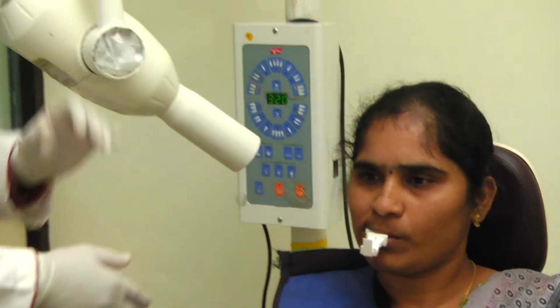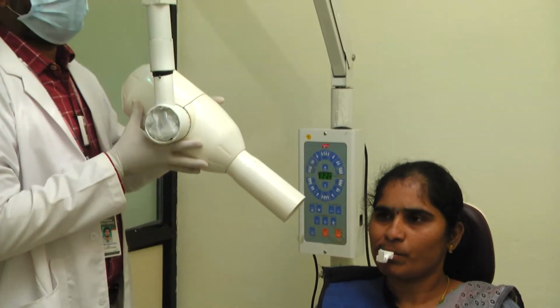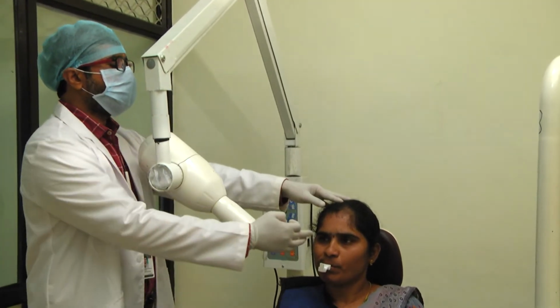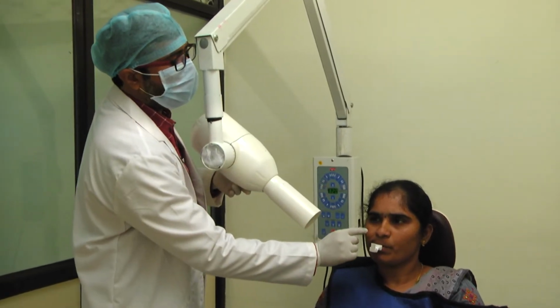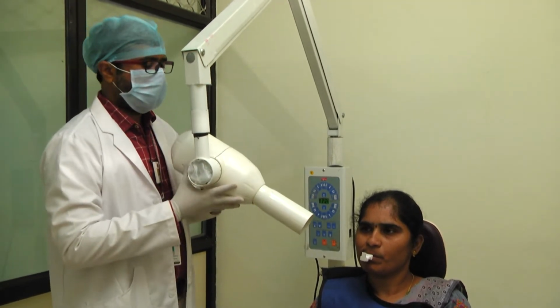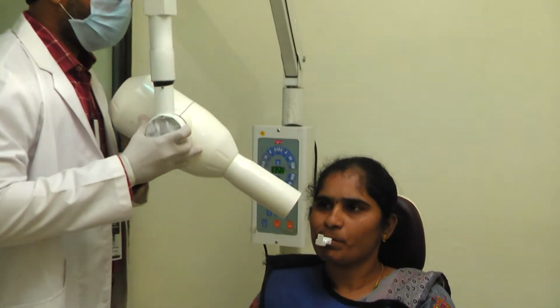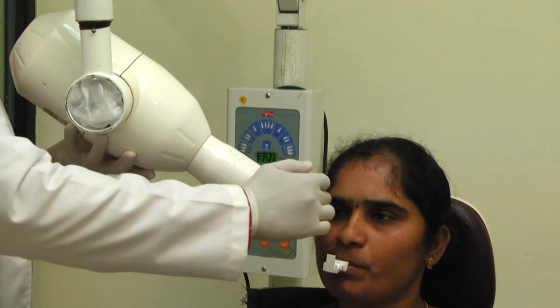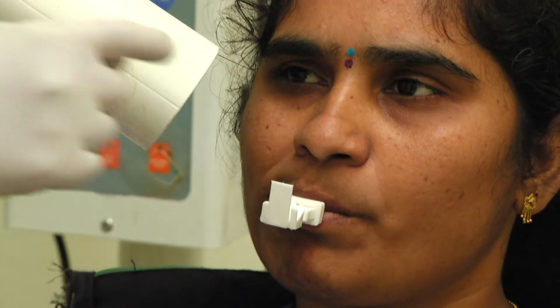head exactly upright, and then the vertical angulation for the maxillary premolar is plus 30 degrees, and the point of entry of the central X-ray beam is exactly just below the pupil. So this is the pupil of the eye. The point of entry is just below the pupil of the eye, at an angulation of plus 30, directing towards your second premolar and first premolar.